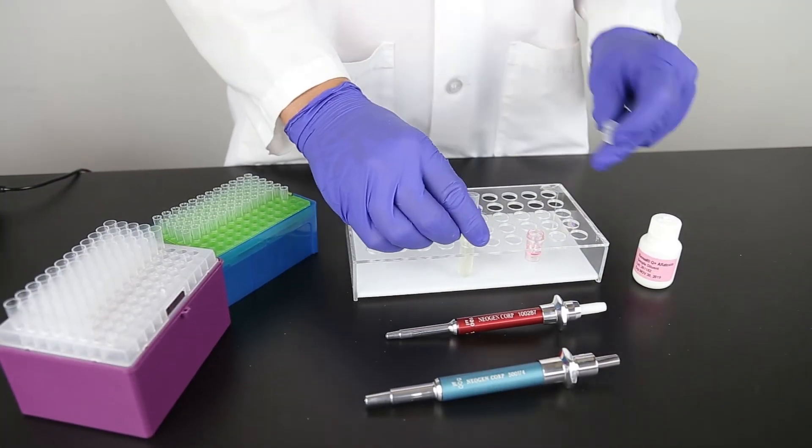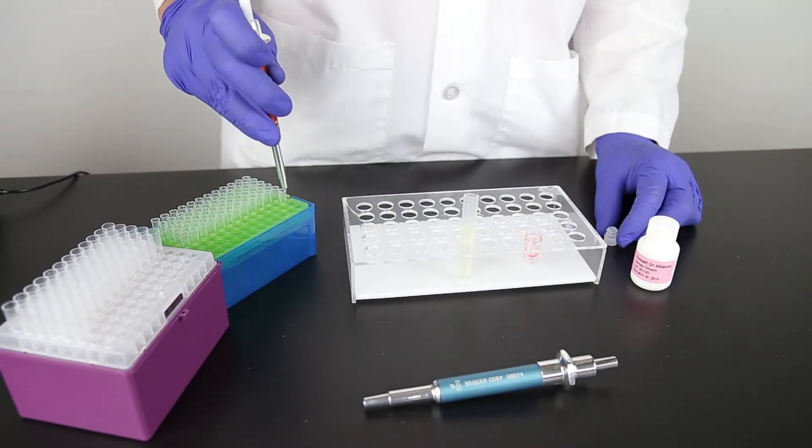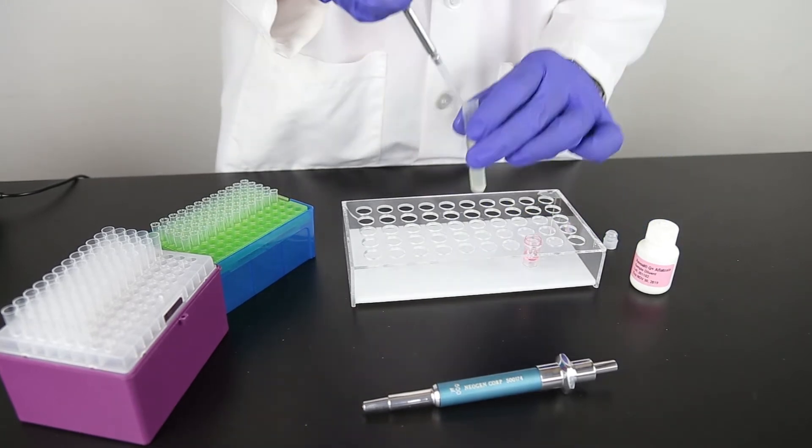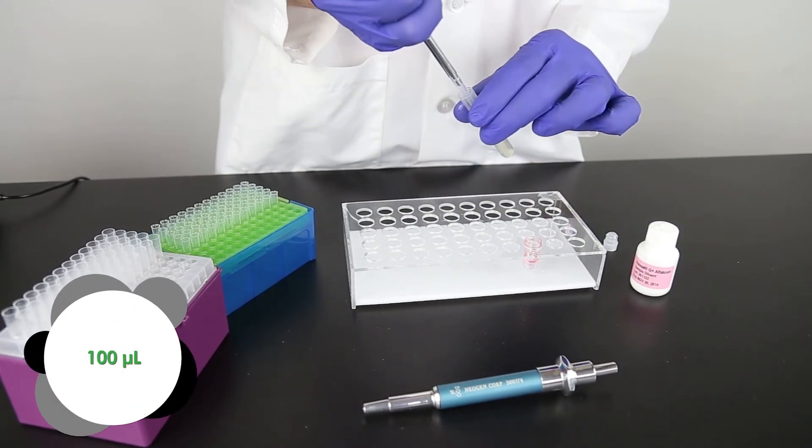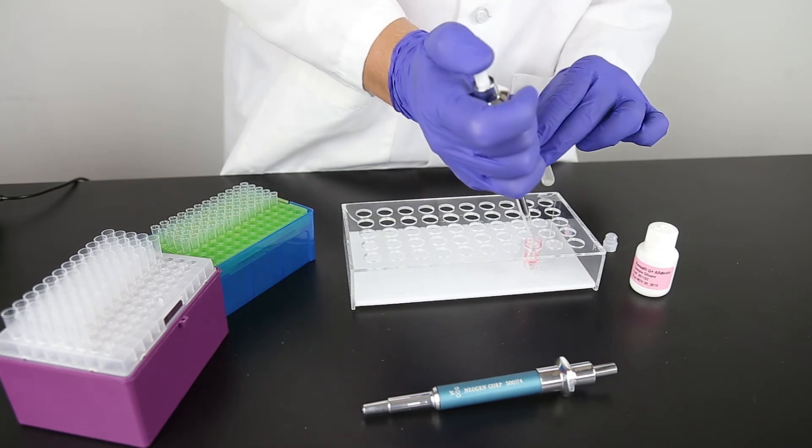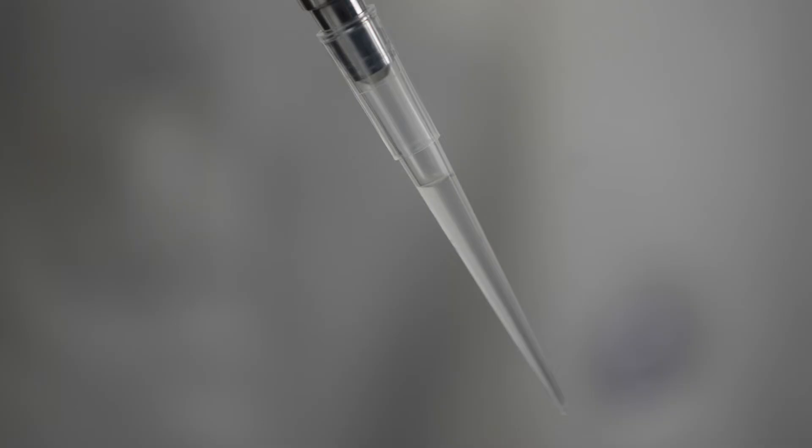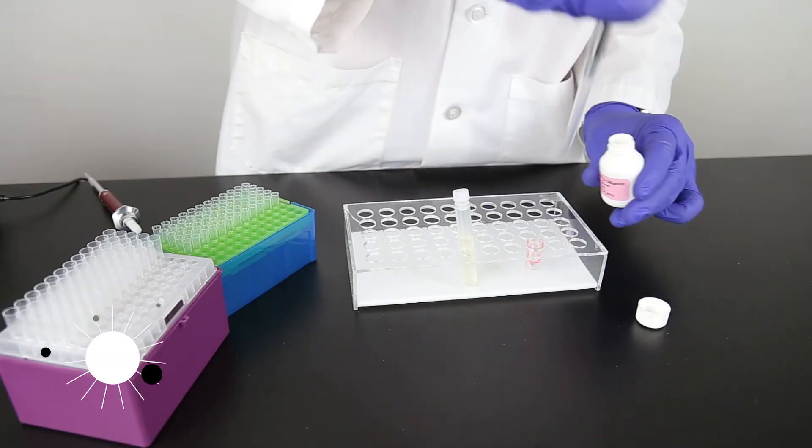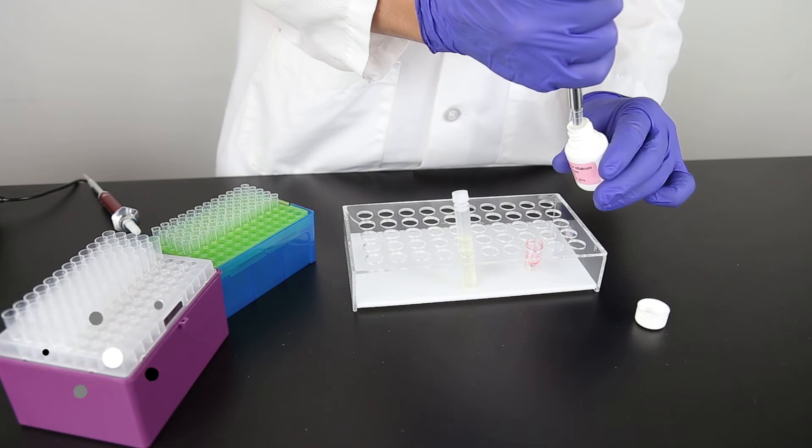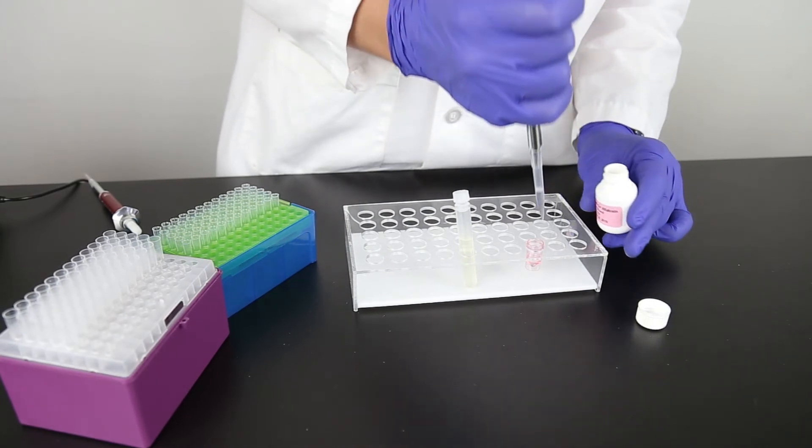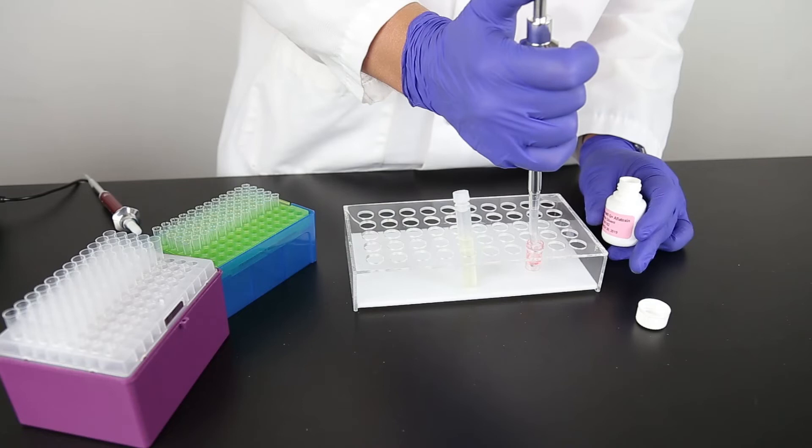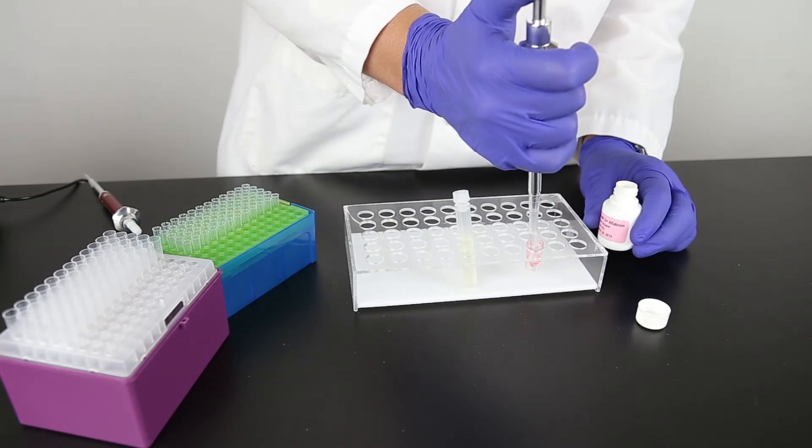For each sample you are testing, place a red dilution cup into the sample rack. Add 100 microliters sample to the red dilution cup. It is important to make sure the pipette tip is fully charged with liquid and doesn't have any air bubbles prior to dispensing the liquid into the cup. Next, add 500 microliters sample diluent to the sample cup. Mix by pipetting up and down five times. It is important to mix thoroughly.